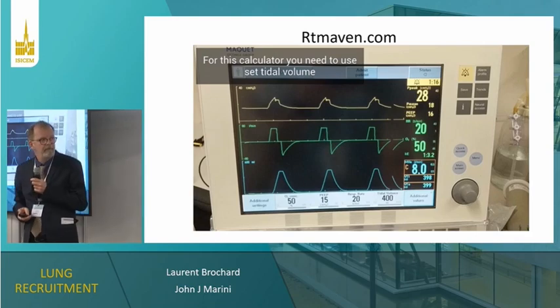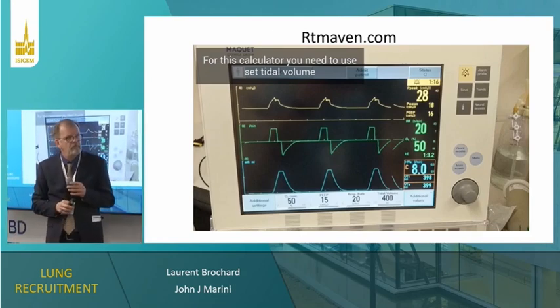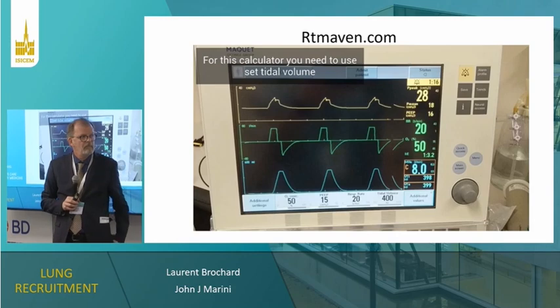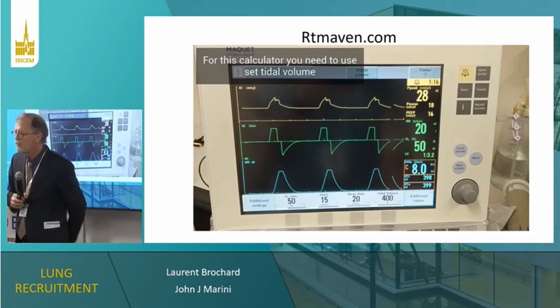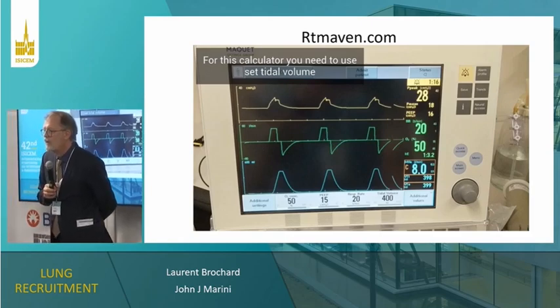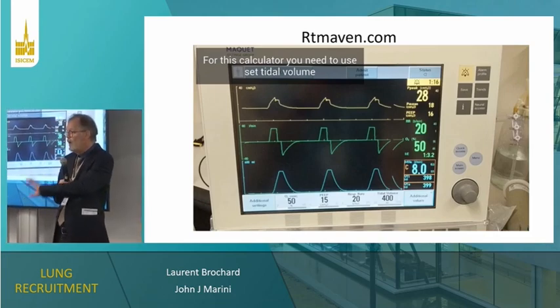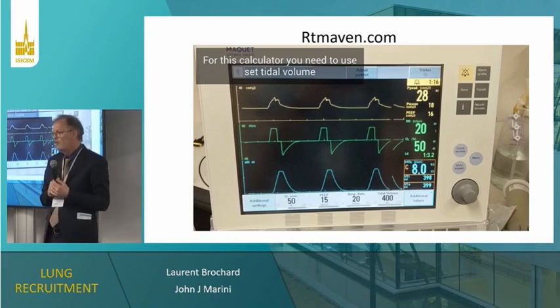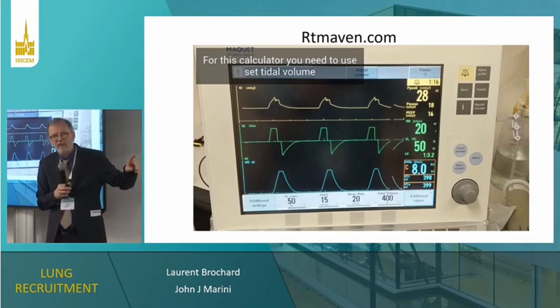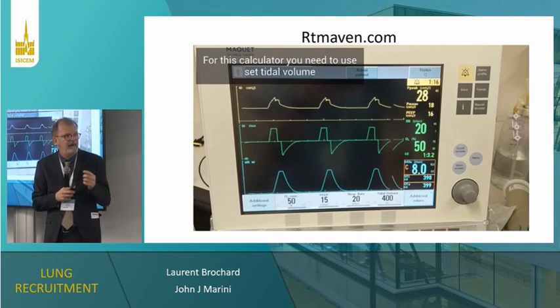It's basically making the baby lung a little bigger. Right. If you're successful, the baby lung is bigger, the compliance is better, and if it doesn't happen, then you have a non-recruitable lung. Are you looking at the compliance at 15 or the compliance at 5? We are essentially looking at the compliance at 5, because this is where the baby lung is, as John said, and we want to know if this baby lung is simply inflated by the PEEP or it's recruited. That's a type of compliance we are not used to measuring, because it's compliance based on delta PEEP, very complicated.